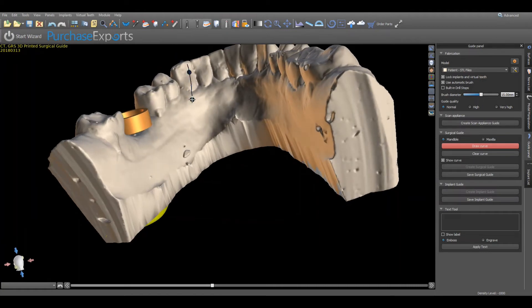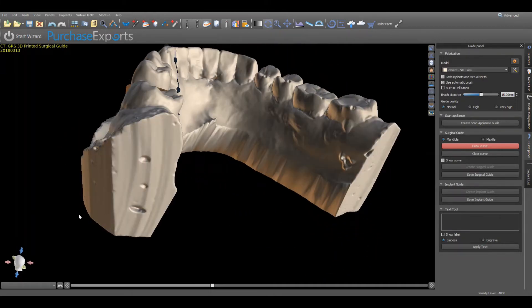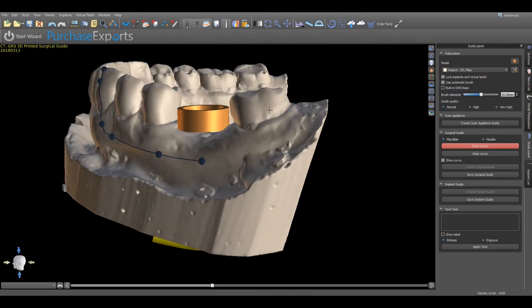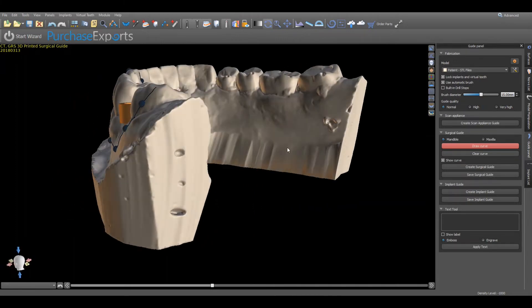Once all nodes have been placed and connected, verify the overall design, taking into consideration all undercuts, interproximal spaces, and anatomic landmarks in order to yield a comfortable and accurately fitting 3D printed surgical guide. If any adjustments are needed, simply place the cursor on the node to be adjusted and by clicking and holding the left mouse button, reposition each node into the desired location.